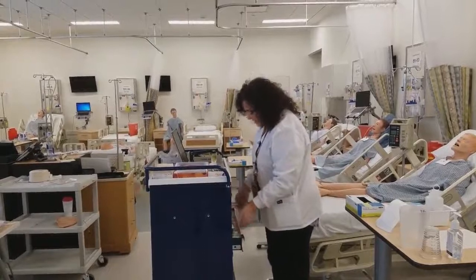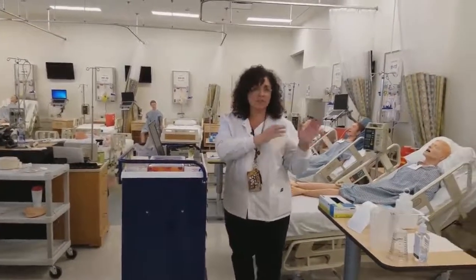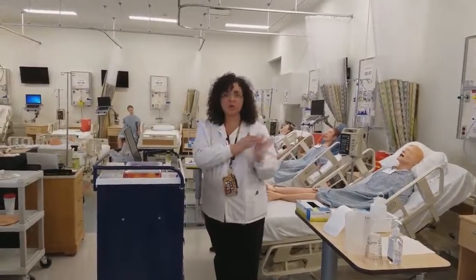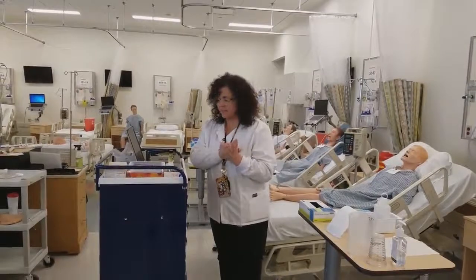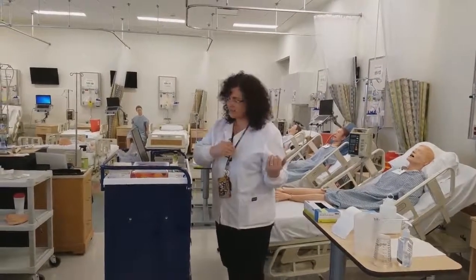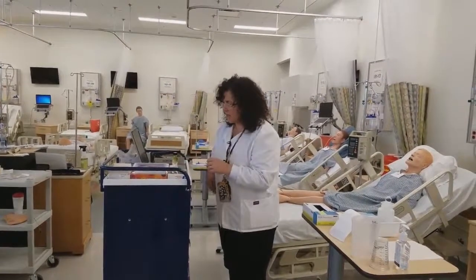Now, at this juncture, my preparation in the NRL hospital is done at the bedside, and each patient has his or her own pill crusher, so I can do everything I need to do at bedside, but I need to think about supplies. What supplies are in the room, and what supplies do I need to take with me? So I need a couple of cups here.